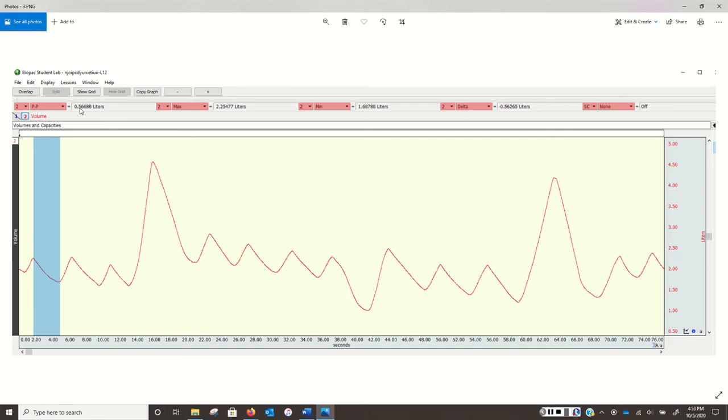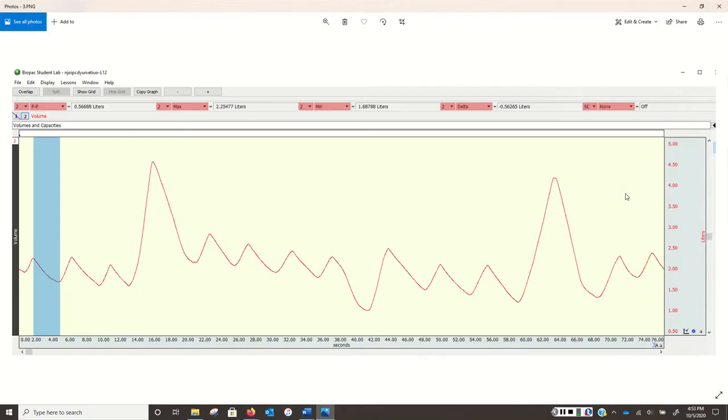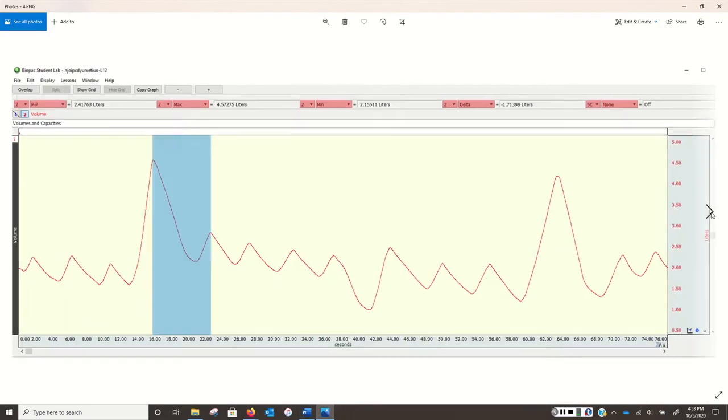567 milliliters. And we can record that right here on our worksheet. Next, I'm going to measure my IRV, my inspiratory reserve volume. And I'm measuring the difference between the peak here and the peak here, from peak to peak.